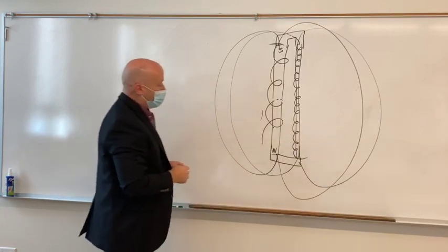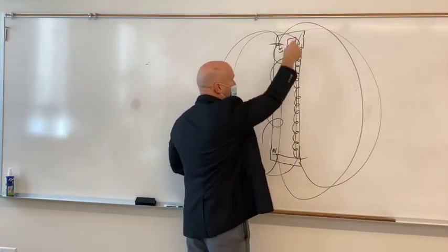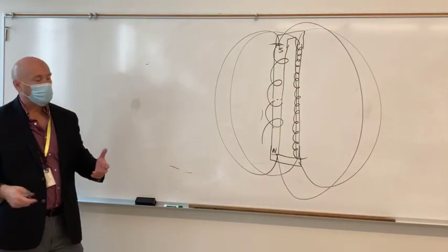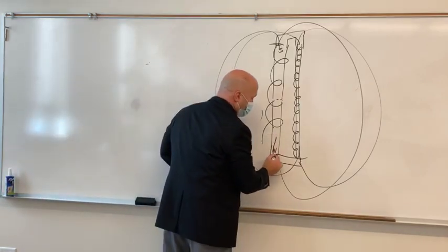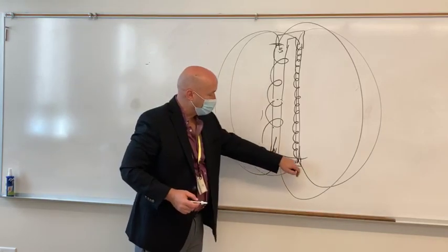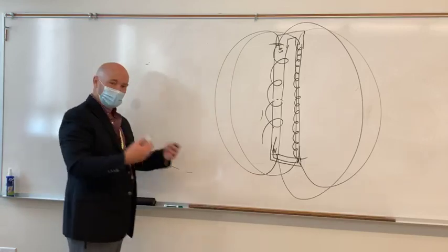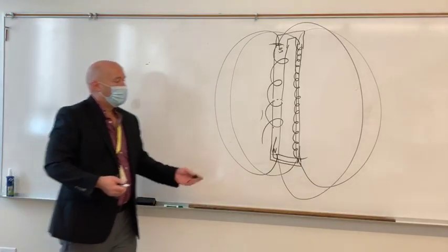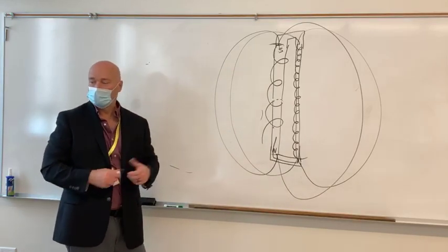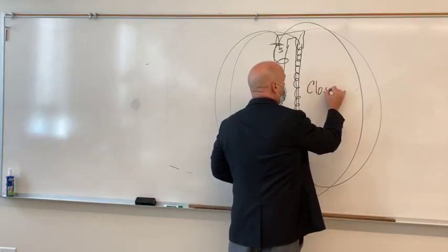Okay, so now our ferromagnetic material is shared between the two, and we've got a common link going in between both of them. So if we've got a common link going in between both of them, does that not give the magnetic field lines an easier place to go? It's coming out of the bottom of this one and going into the top of that one, which is still, we've still got the same problem with switching pole strengths, but does it not give the magnetic field a place to go? Sure it does, right?